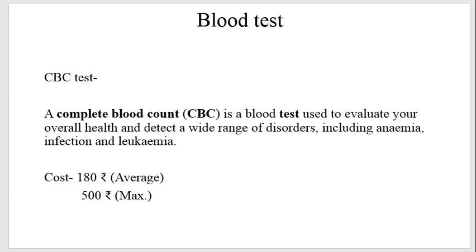So generally they are taken in 2 tubes. Those tubes are EDTA coated to avoid coagulation, and they are 2 ml tubes where they collect the blood. There are other tubes where there are predefined platelet, RBC lysing solutions or WBC lysing solutions for the other counts. So the RBC lysing solution is used to remove the RBCs so that WBCs can be easily counted. So that's why they put it in the tubes.